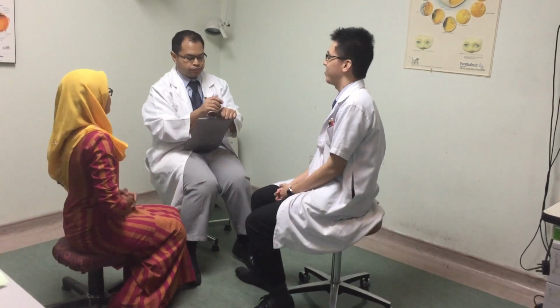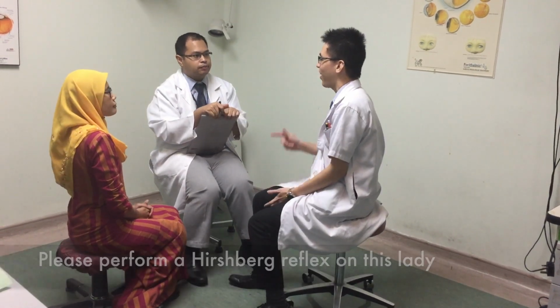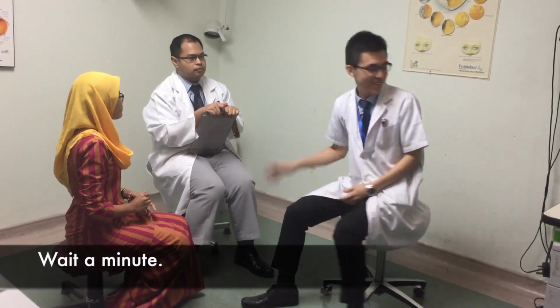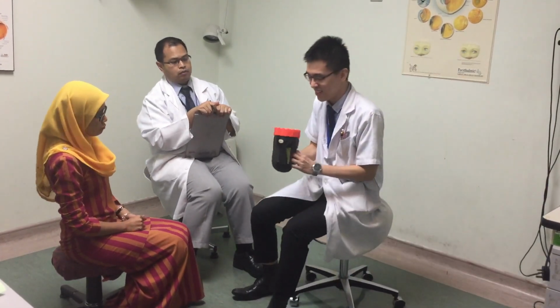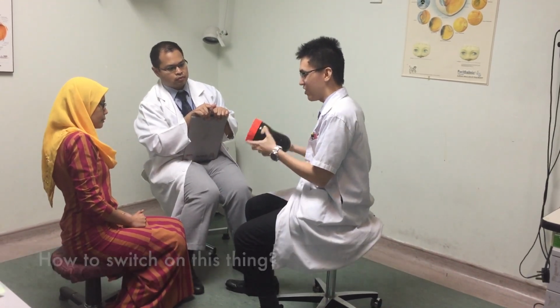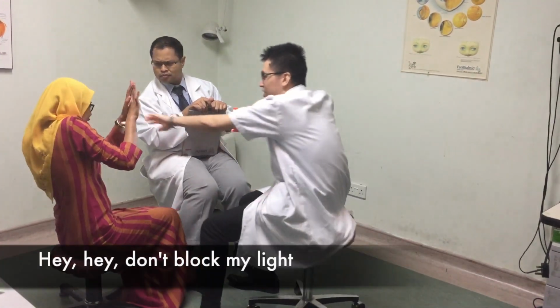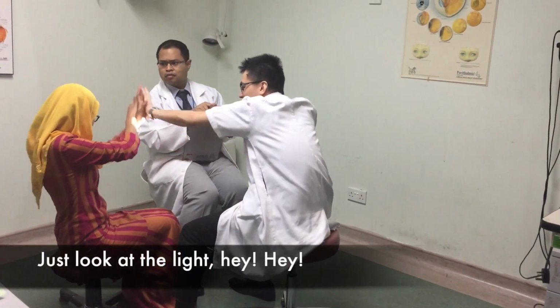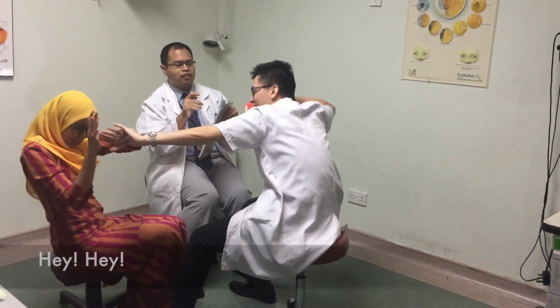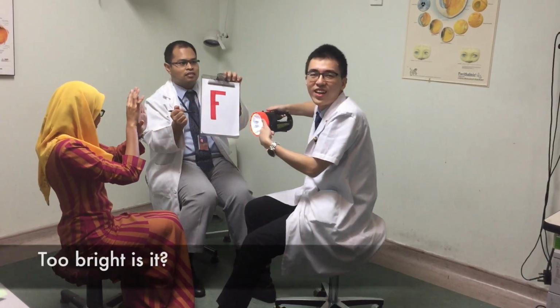Morning, sir. Candidate Z, please perform a Hirschberg reflex on this lady. Hirschberg. Easier like that also they ask, huh? Wait a minute. How to on this thing, please look at the light. Oh, it's too bright. Hey, don't block my light. Just look at the light. Wait. Look at the light. Focus here. Focus. Hey. No. Fail already, fail. Huh? Here. Too bright, is it?